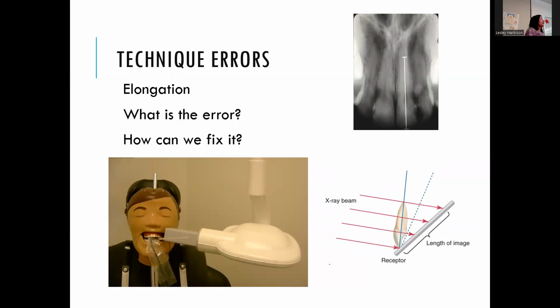This is pretty common, and sometimes you have to do it on purpose. Sometimes you just have to distort something to get the image. And that does happen sometimes. A lot of times your instructor will be with you because you'll have tried the other way and it didn't work, and they're like, we're just going to do this to make it work. So sometimes you do have to just distort the image.